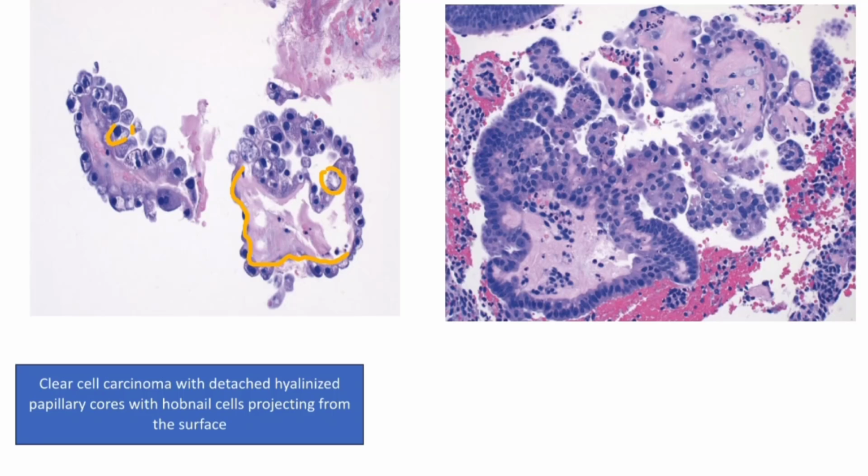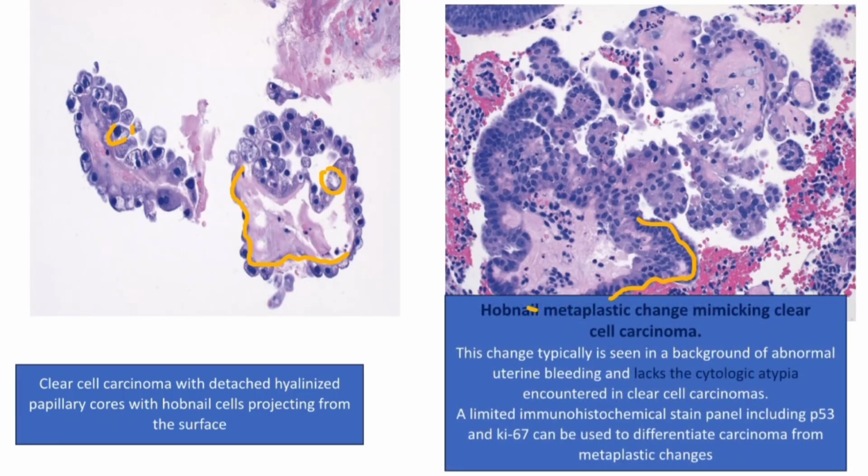See, here these are the nuclear feature having benign appearance and lack of cytological atypia. Compare here, this is high grade nuclear feature.